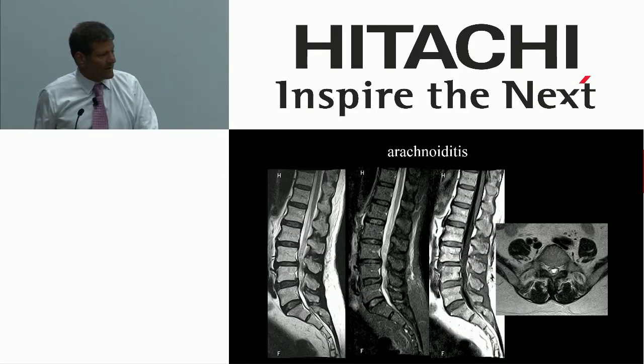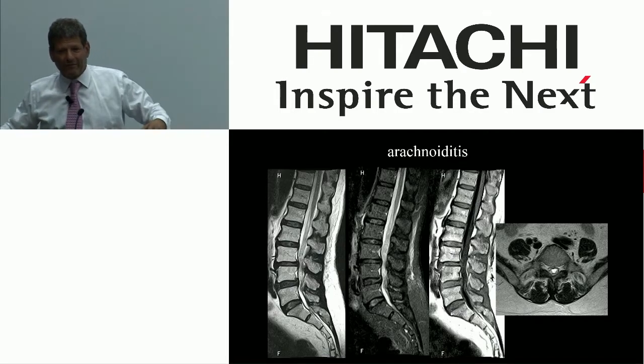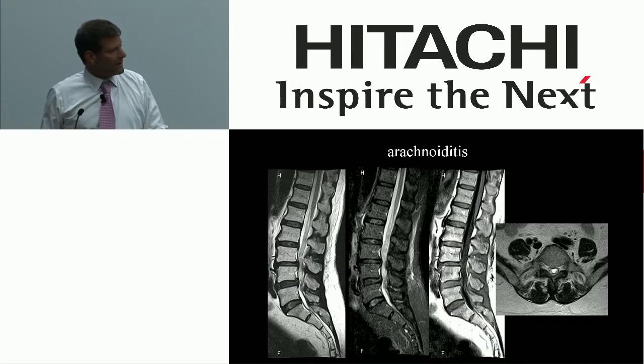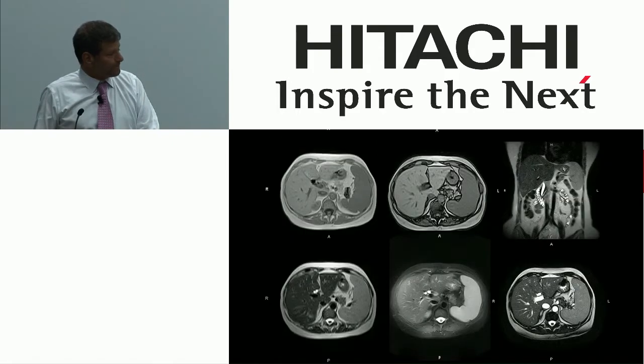This patient has arachnoiditis. For those of you who like to look at images, you see we're all clumped up in here. You see how it gets kind of congested in here? And the nerve roots are all peripherally distributed. They really should be sort of floating in there. That's an example of arachnoiditis. Thoracic spines, again, not a particular challenge on these machines.